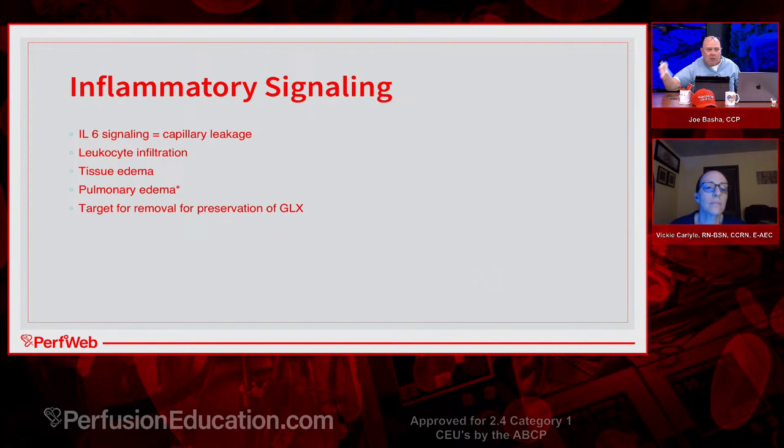So inflammatory mediators are a real problem in any extracorporeal circulatory device, whether it be VA ECMO, VV ECMO, or standard cardiopulmonary bypass, or angiovac procedure for that matter, something we have to seriously take into consideration. It's usually well tolerated, especially for short run cardiopulmonary bypass procedures, 3 hours or less, but it's a lot less tolerated when the surgery takes 6 hours on bypass or longer, or you have somebody on ECMO for 3 days, 4 days, 5 days, 10 days, 20 days, 30 days.